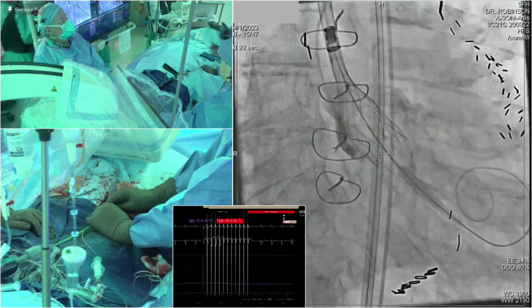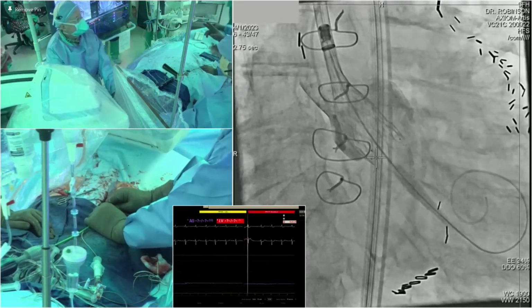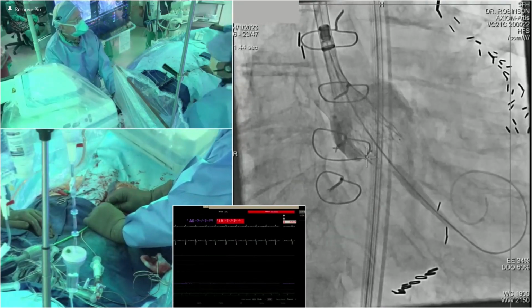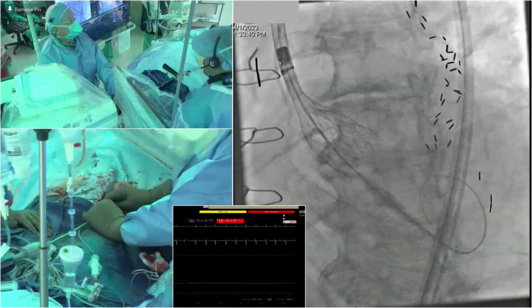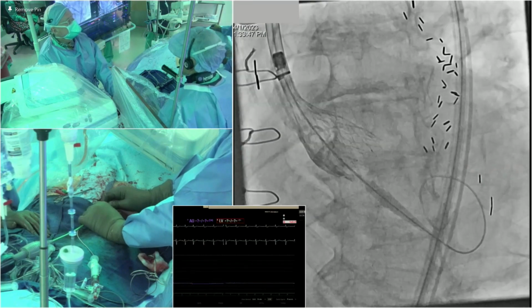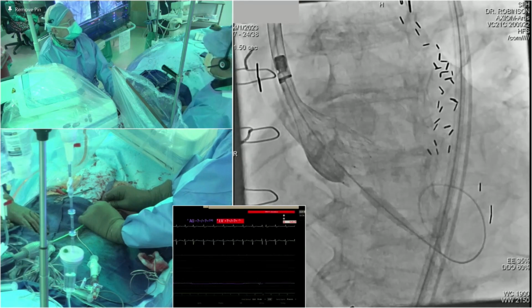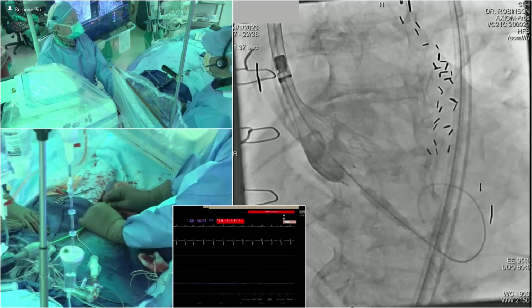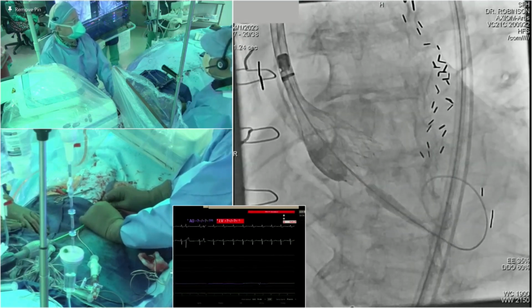By the way, in this view, the other thing about commissural alignment, 2 of the dots are on the left-hand side, 1 on the right. And that proves we've achieved perfect commissural alignment, which is really important for re-engaging the coronaries in Evolut. Probably good for flow dynamics in the sinus and reducing leaflet thrombosis as well. So that shot proves that the valve is in a good position on the right-hand side of the screen at the left coronary sinus, and the valve is below the annulus. So I think we're ready to let it go.